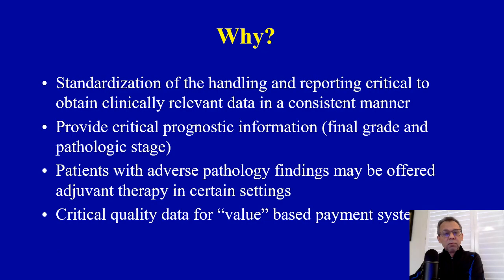So here are some reasons why you need to be thoroughly informed about this particular topic. Standardization of the handling and reporting is critical to obtain clinically relevant data in a consistent manner. It provides critical prognostic information, what we call final pathologic stage as well as final Gleason grade.